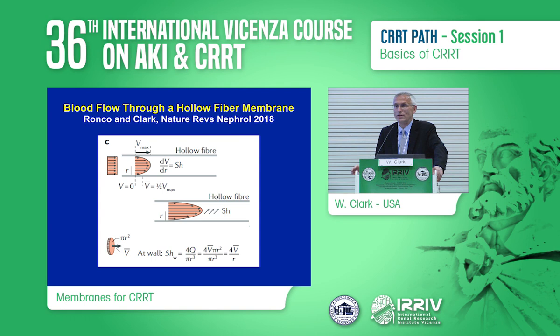Now, if we look further into what's actually going on inside an individual hollow fiber, again, we're talking about blood as a Newtonian fluid and also laminar flow. So first of all, laminar flow simply means that blood flows according to, if you will, streamlines through the cylinder or through the hollow fiber. Now that's opposed to turbulent flow, where there's vortexes and eddy flow, which disturbs that nice smooth laminar flow, which occurs for the most part in traditional dialysis therapies.